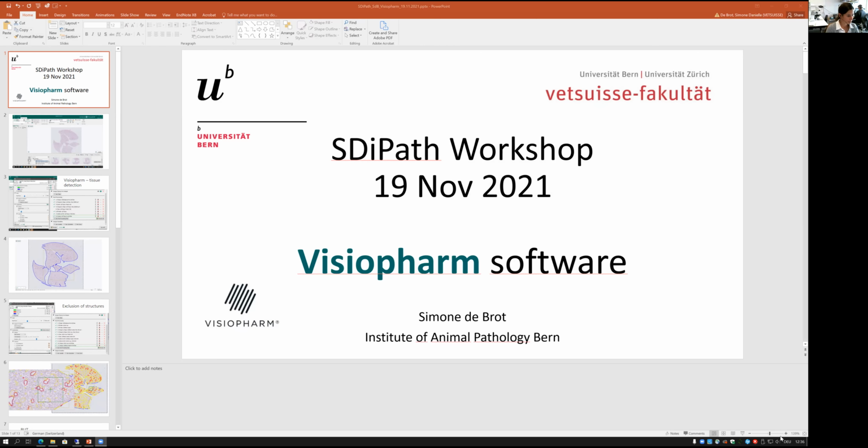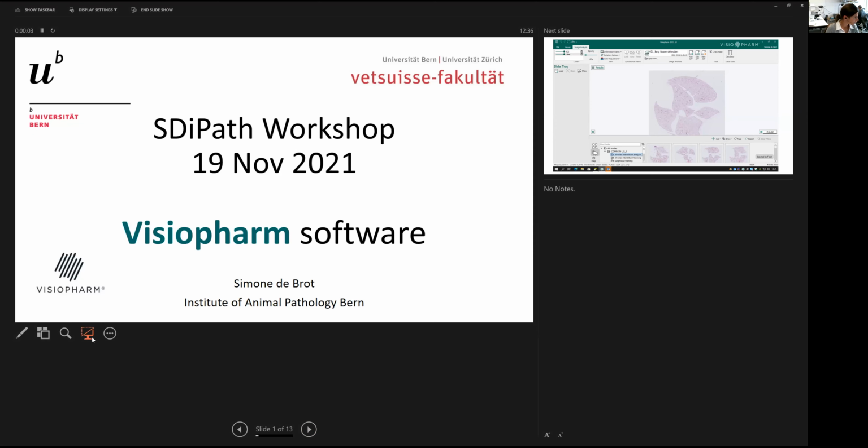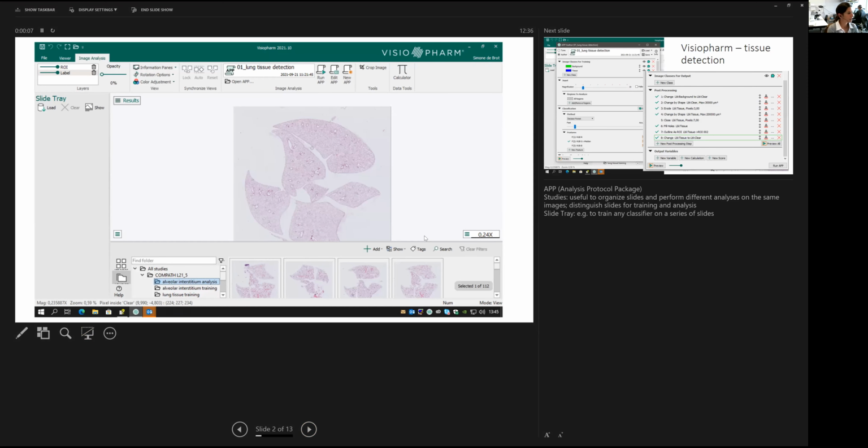So I thought maybe it's best to show you an example. I think you should see this, okay. Yes, what I'm trying to assess and where I think the software performs quite well. You may see that's the working space, and there is an option to have the slide, obviously, where you annotate or select any region you would like to assess.